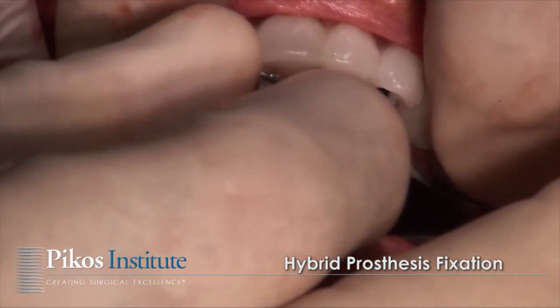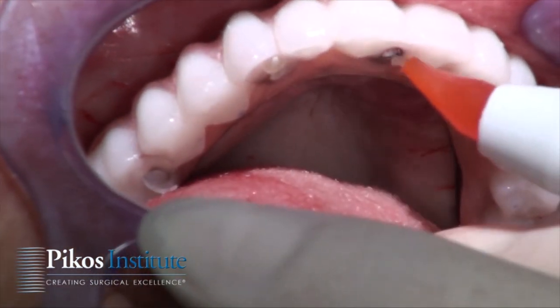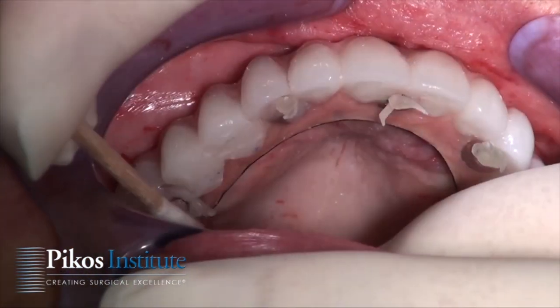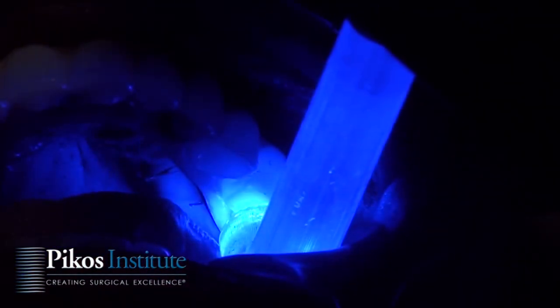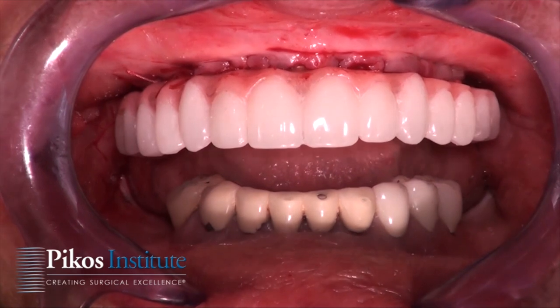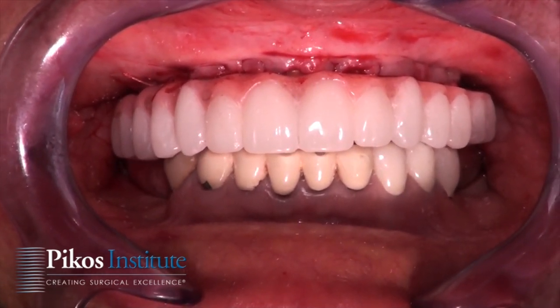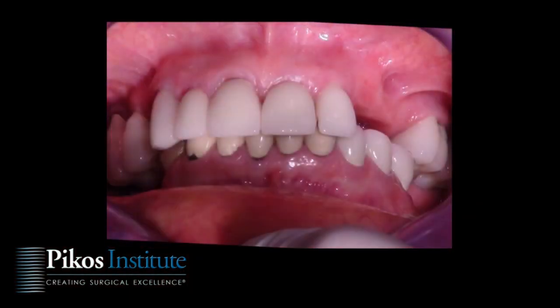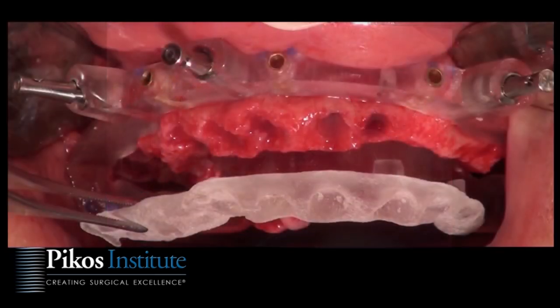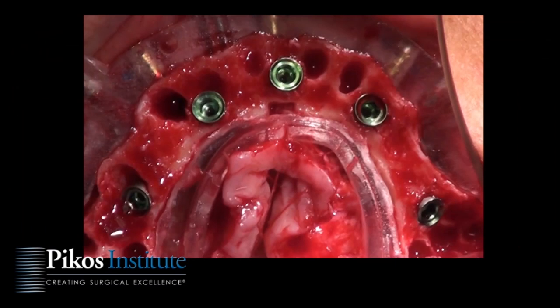And once that is accomplished, of course, we'll verify the occlusion once again. And typically, it's just a matter of minutes to equilibrate even a two-arch case. So when we look at this, this is a dual cure flowable composite that we utilize. And the lower arch will be addressed at a later date. This patient, due to finances, can only afford one arch for now, but that's fine. When I say addressed, I don't mean we have to do full arch reconstruction at that point, but appropriate restorative work that needs to be done.